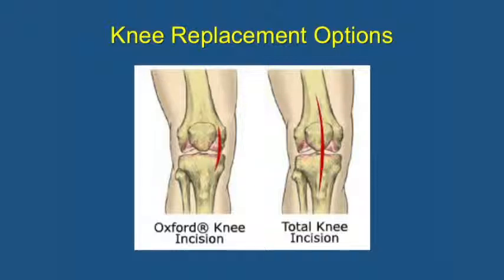It can be a little bit softer in the hip, if you will, and we treat it differently in the hip because, just to get off topic, we're looking at different mechanical forces in the hip, and so we can cross-link the hip polyethylene more safely. If you're following me on the biomechanics, you're going to get better wear but weaker poly. Make sense?